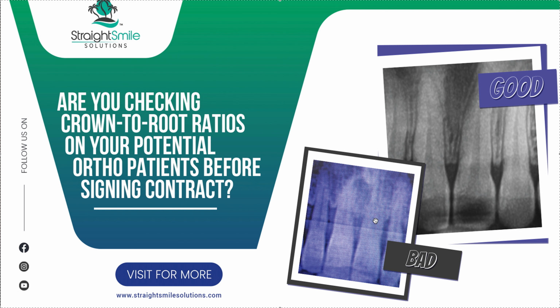So I always recommend, this is not a borderline case to me. But if there's a borderline case at about 50%, and I don't have one here, I just did clear, good, and bad, but if there's something in the middle, first of all, always confirm it with a PA x-ray. Because if the tooth is at a funny inclination, it might make it look worse than it is. For example, if it's really flared, it's going to look strange, and it's really not going to be like that. So verify it with a PA. Of course, if you've got a CBCT, you can verify it that way as well. I'm going old school because not all of you have CBCTs.